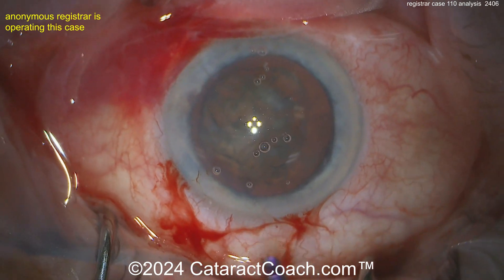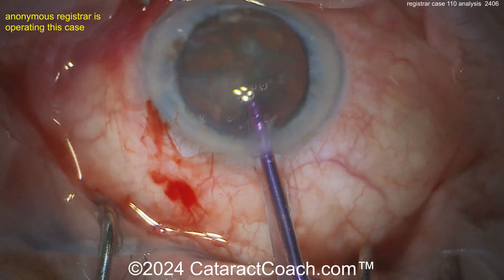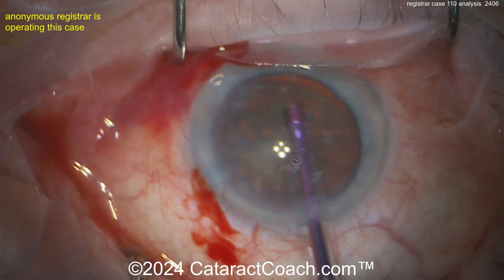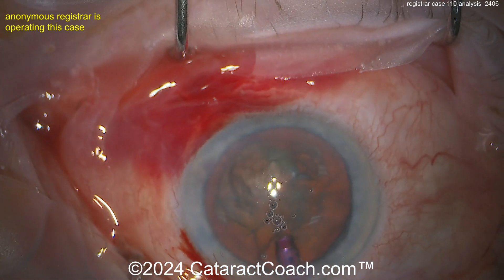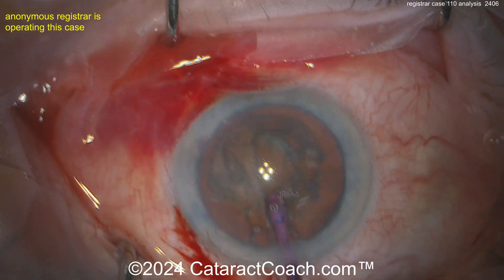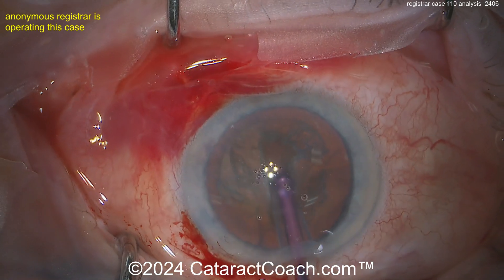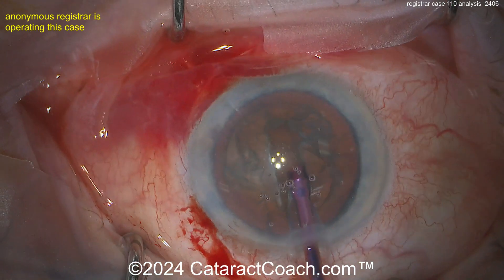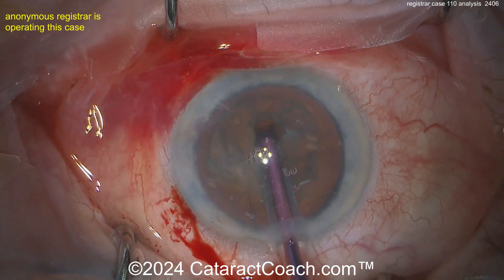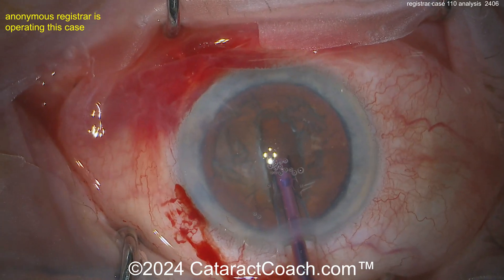Draping is pretty good too. Here comes the phaco probe going in — don't worry about those bubbles. It's going to be a stop-and-chop, so let's see that groove down the middle. Notice how the four lights of the microscope stay relatively centrally the whole time — that's good. Keeping the lights there means keeping the eye in primary position; you want to move and pivot your hand and keep the eye in that primary position. Widening up the groove — this is done really well.